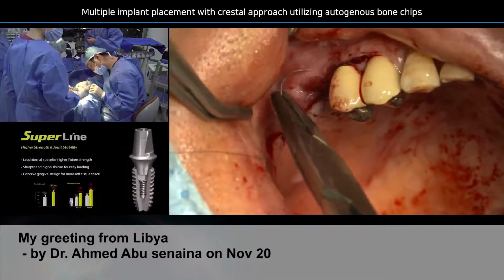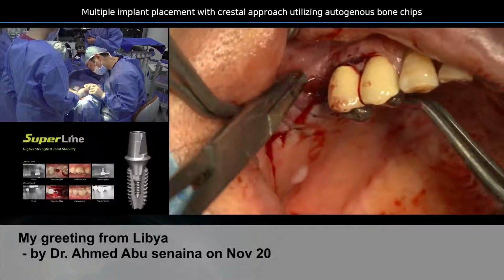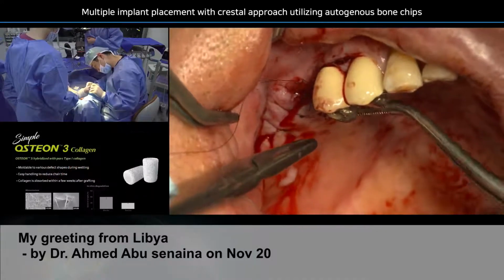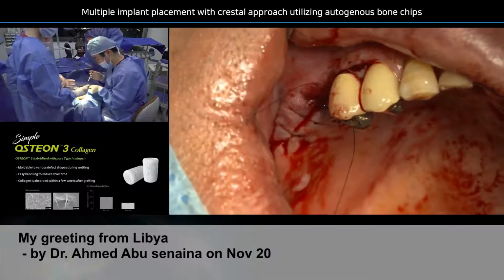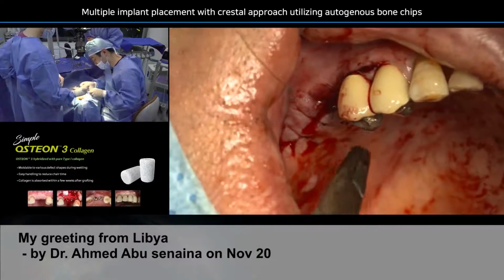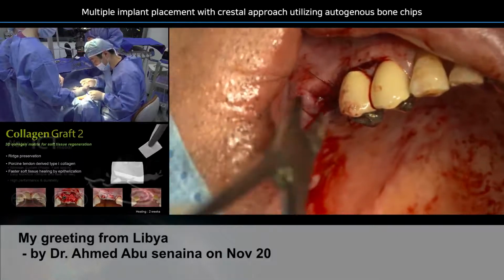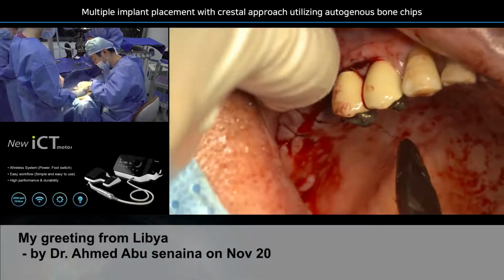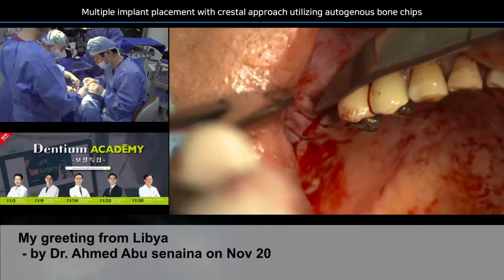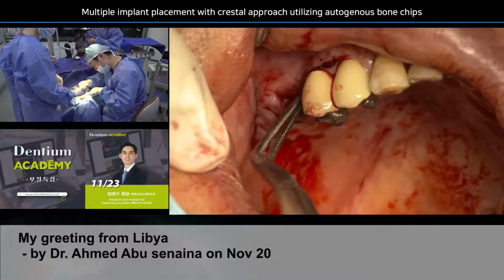I think that one more at the medial aspect here will be required. And at the papilla-based releasing incision at tooth number 14 and 15, you just do the simple interrupted suture and it will heal beautifully without any scar formation. This is the amazing healing potential only you can see at the papilla-based releasing incision. So I'm moving the suture knots to the palatal side.